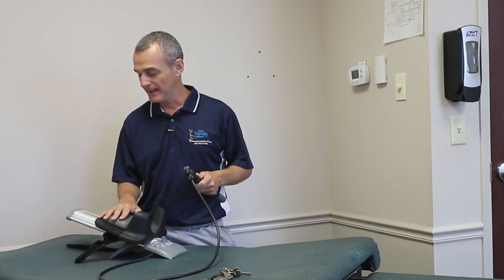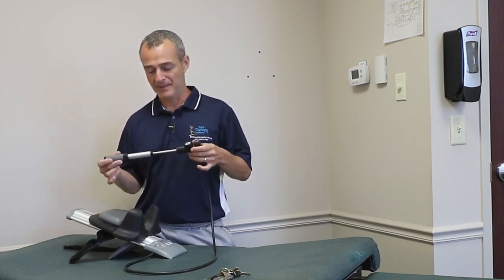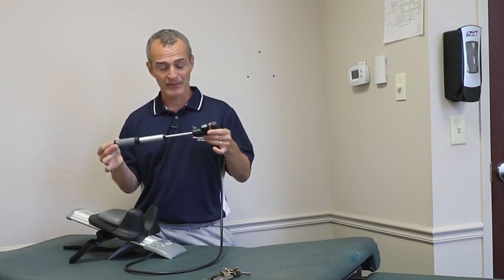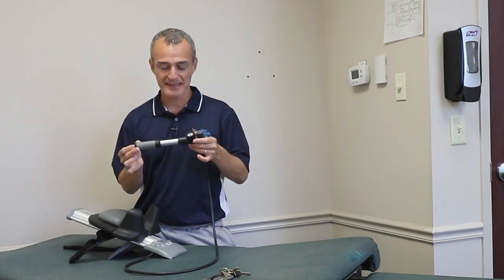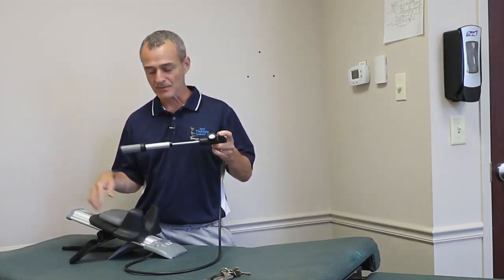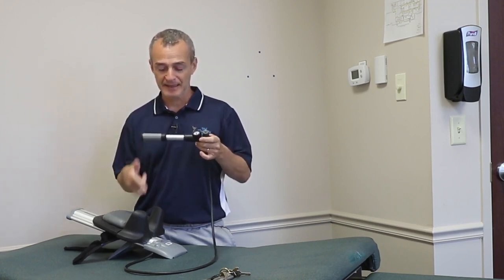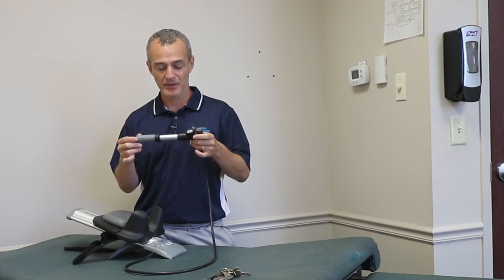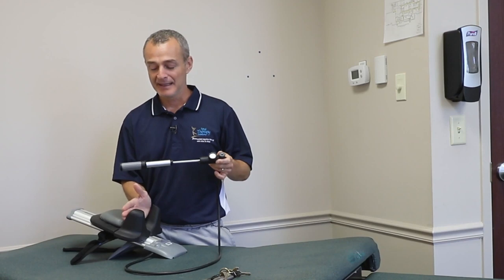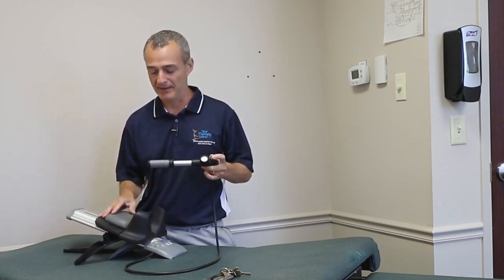It's a working unit. Aside from that, the other thing that will sometimes start to happen is the gaskets in here. So normally when you buy it new off the shelf, whether you push in or you pull out, the carriage will rise. On this unit, because we've used it so long, when I push in, I get the carriage to move, but when I pull out, well, it worked that time. Sometimes it works, sometimes it doesn't. Nonetheless, it doesn't lose air. It maintains that pressure pretty well.